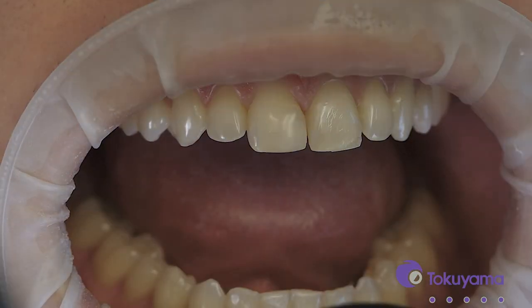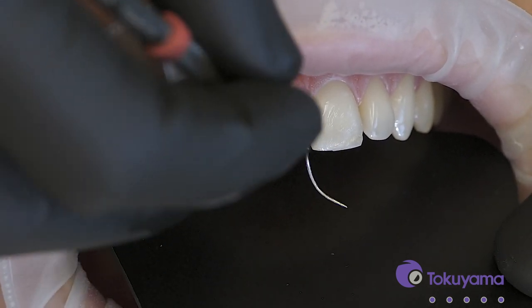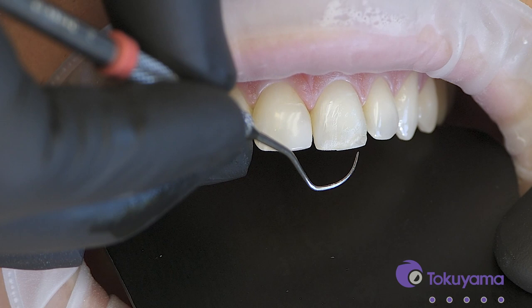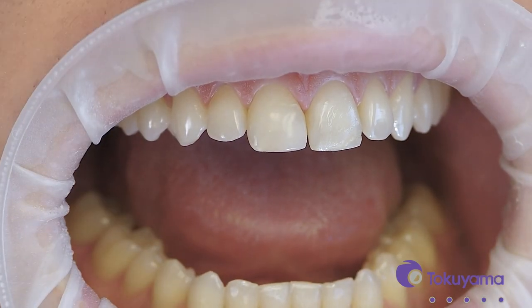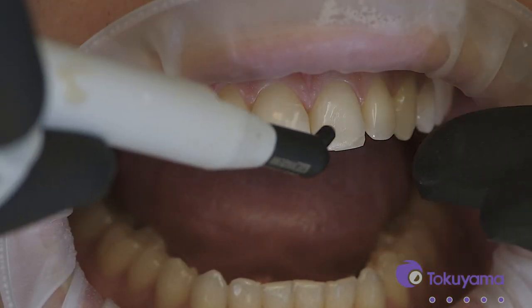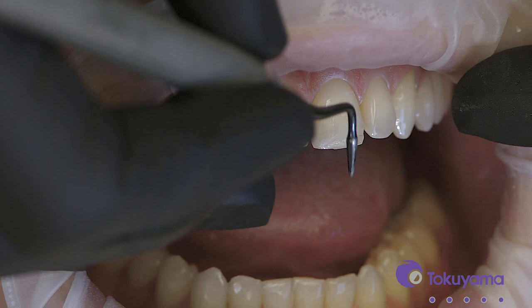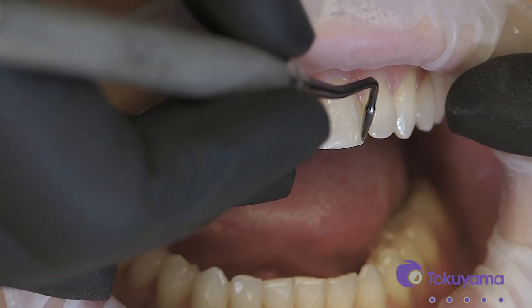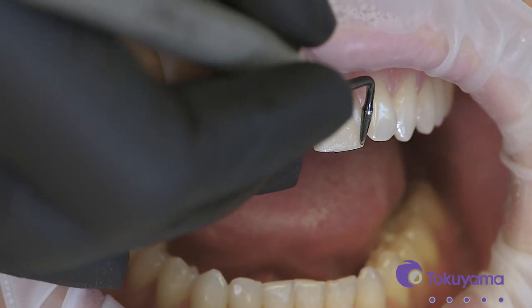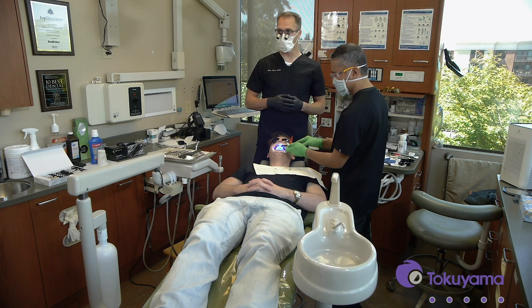With the contrast on here, you can still slightly see a very faint translucent area, so maybe I didn't get quite the thickness I needed on the blocker. Fortunately, we can still just add a little bit more at this point. I'll take just a little dab and push it right up into that space — and that looks better. I can see there's no light going through that hard line; it blocks it out really nice.